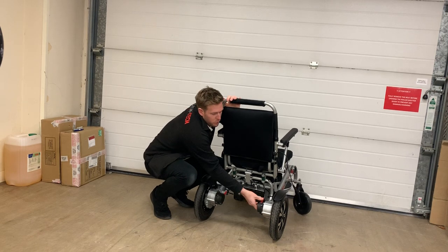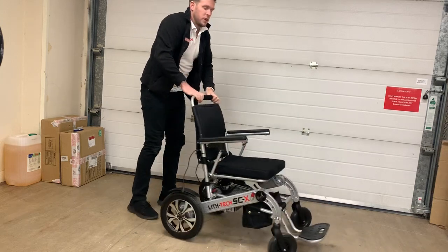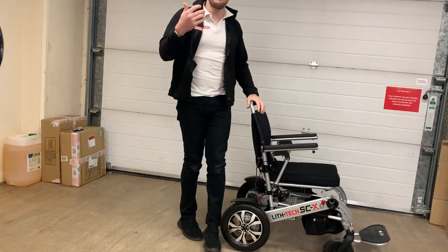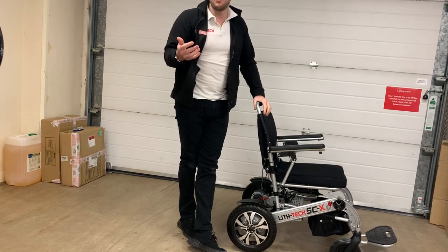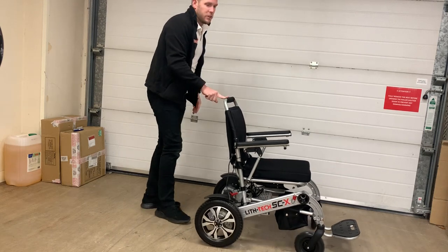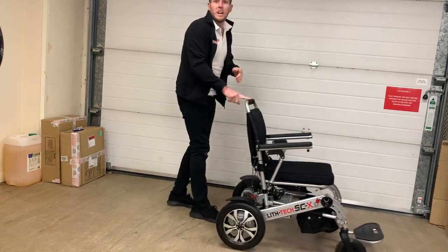When you push the levers forward, the chair goes into push mode. There's not another chair on the market that can be pushed as easily as this. Basically the better quality the motors, the more freely the wheels will run. I could push a grown 20-stone man in this chair simply with one finger.